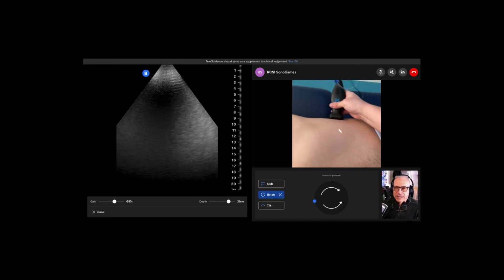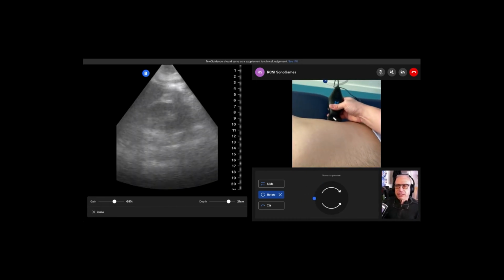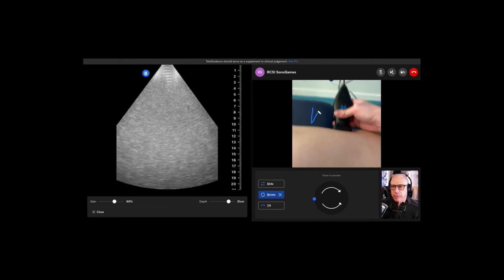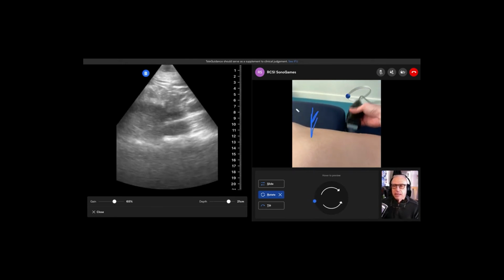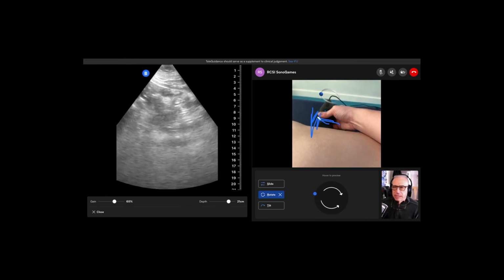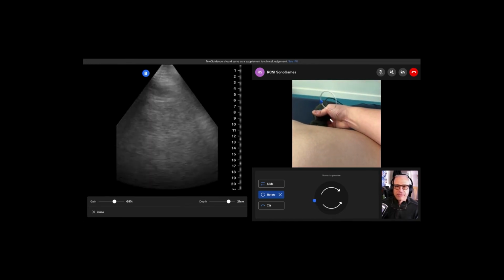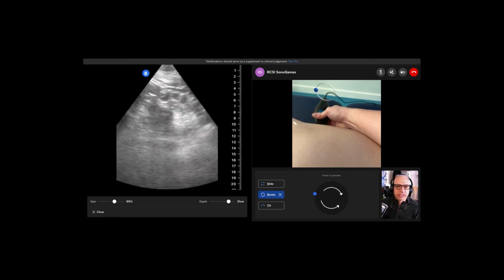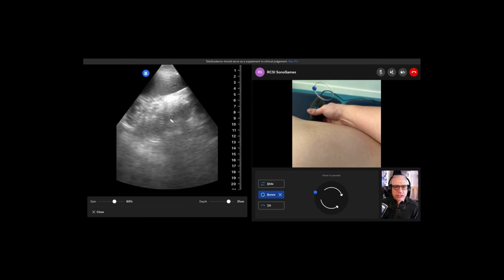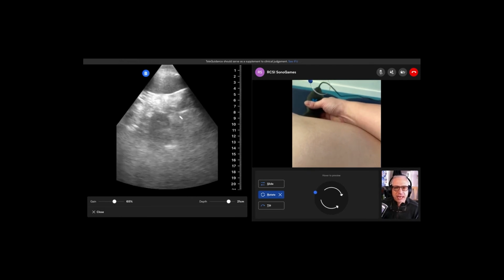Because this is a harder image to get. Instead of being at 10 o'clock, you want to be with knuckles in the bed. So you want to be right over here. Slide up a little bit this way. Okay. There you go. And now fan really close to the bed surface itself. So this can be a little more challenging. You have to move around sometimes to find that. There it is. You just had a good view.